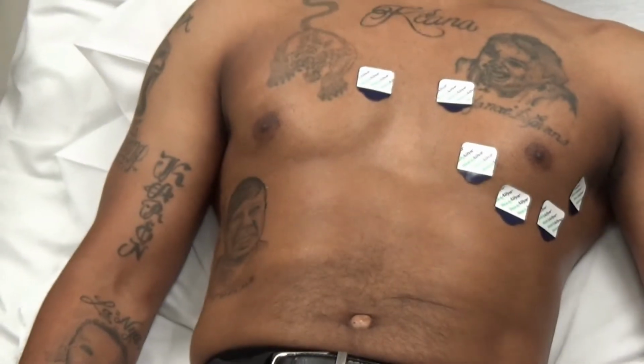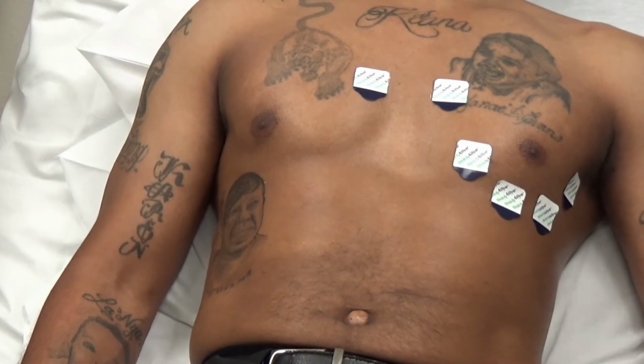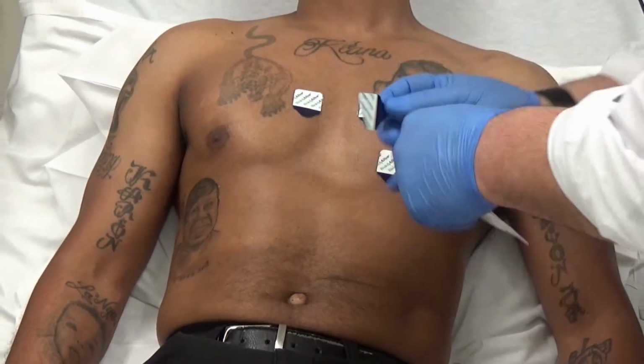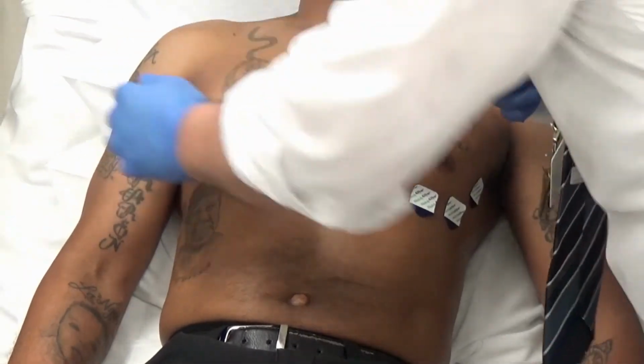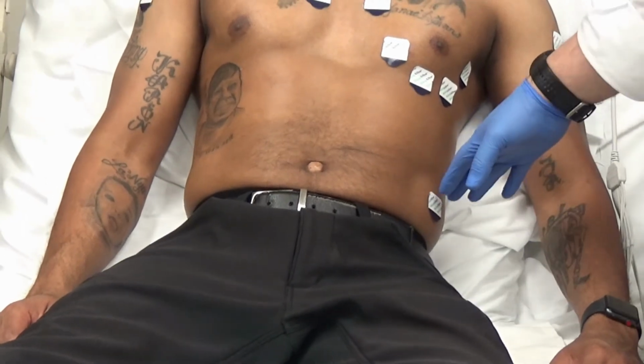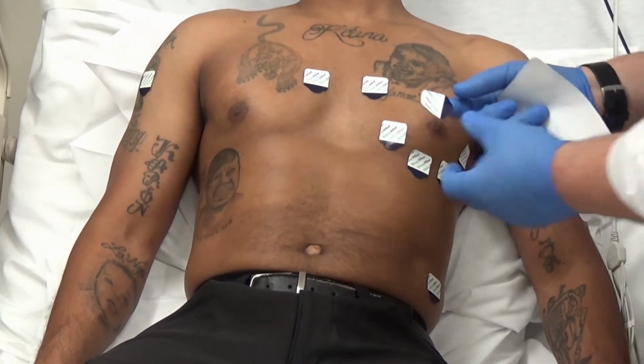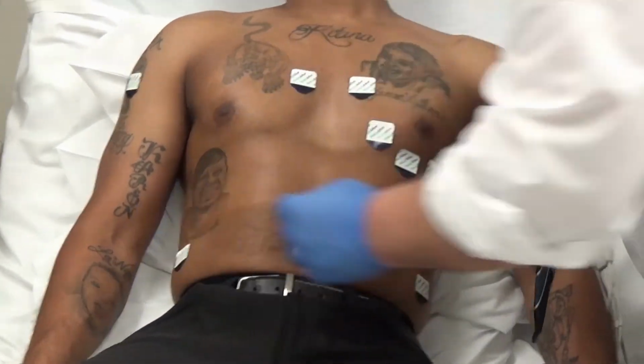The remaining 4 of your 12 lead will be your limb leads. So your left upper, your right upper, your left lower. Now your left lower can either go here or anywhere below your chest leads. And this would be your right upper.